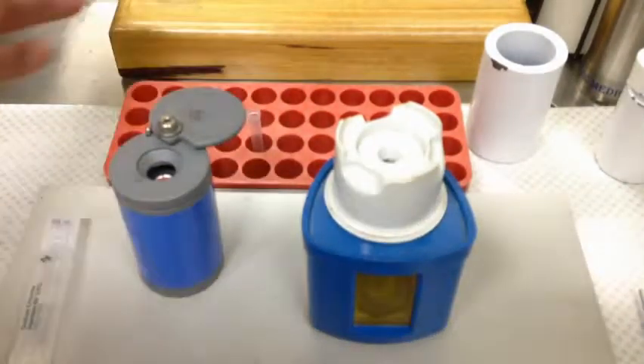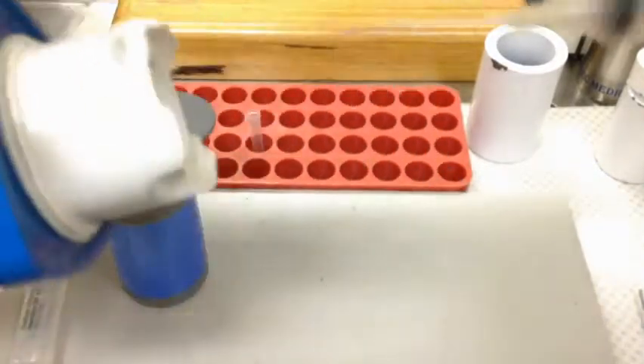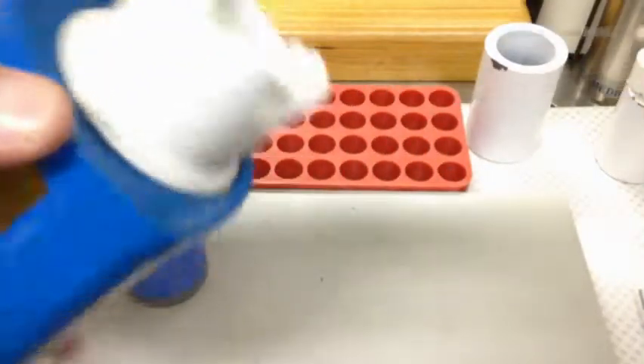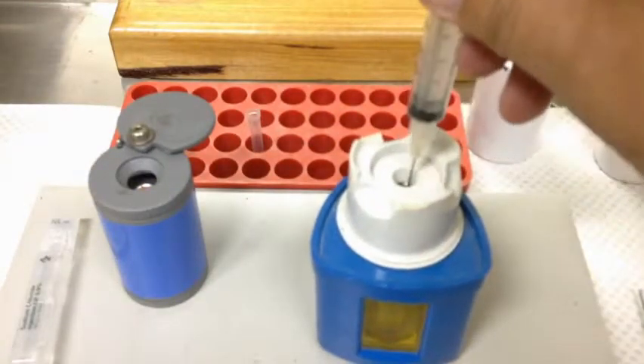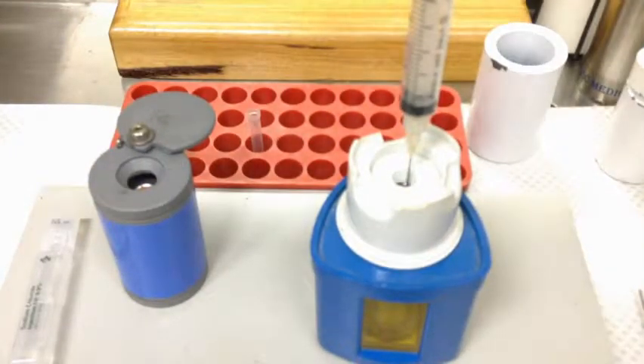Needle cap off. Needle cap goes in for recapping after. Now some people will do this but you can't see. These are fairly robust — there's no reason why you can't just pop the needle cap in vertically from the top while you're looking at it.